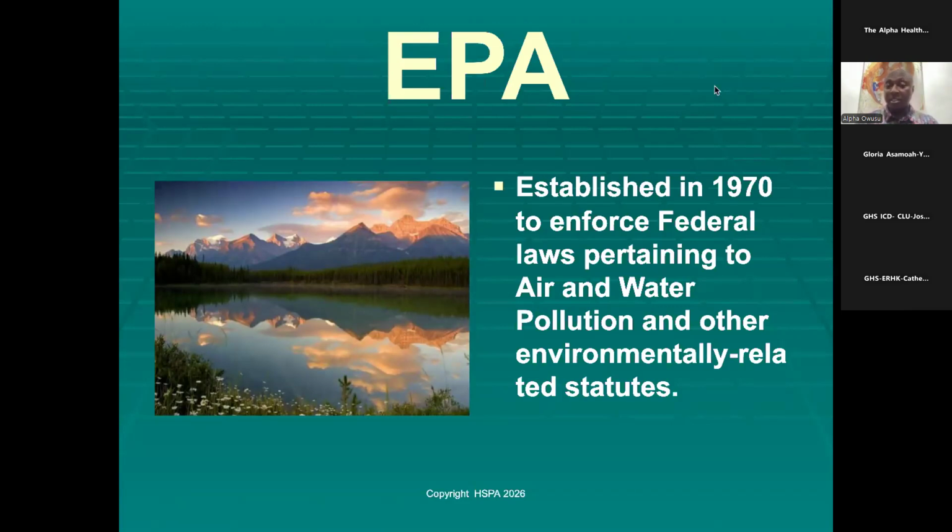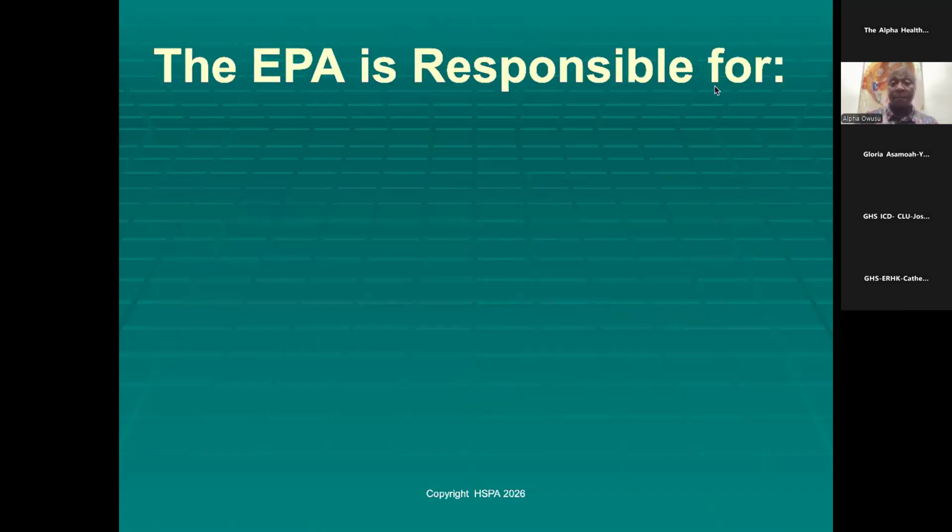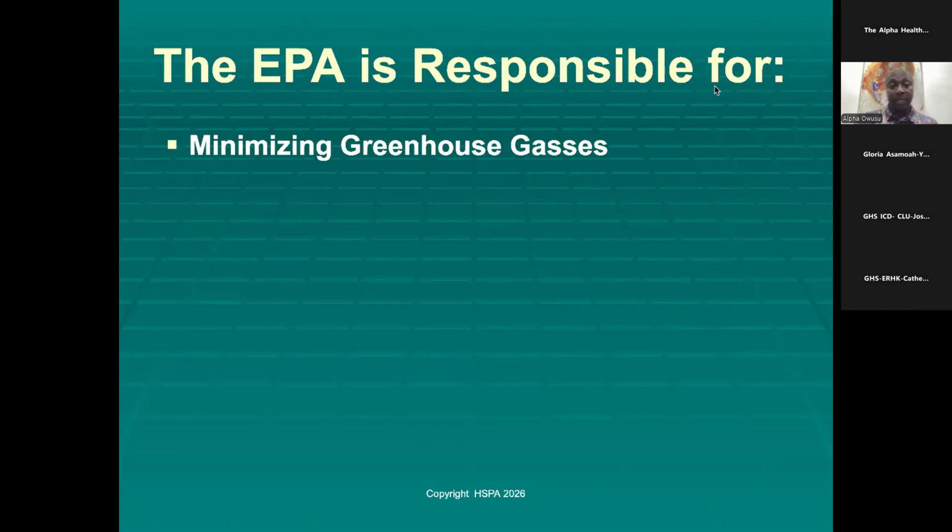If it is a positive pressure, it means air leaves there, right? But because anything in the decontamination area is considered contaminated, the air should be negative so that it does not contaminate the environment. So we need to look at all these under the EPA regulation, right?